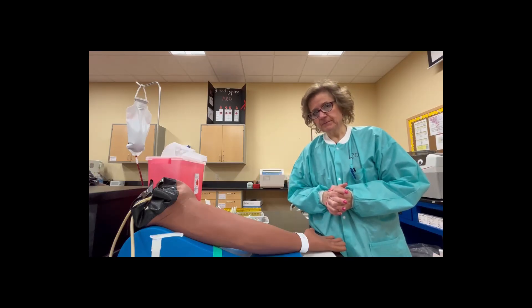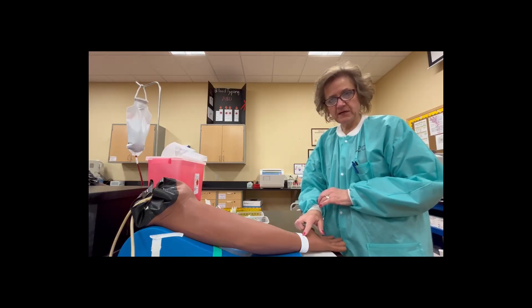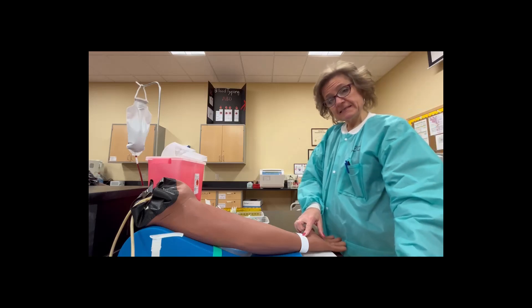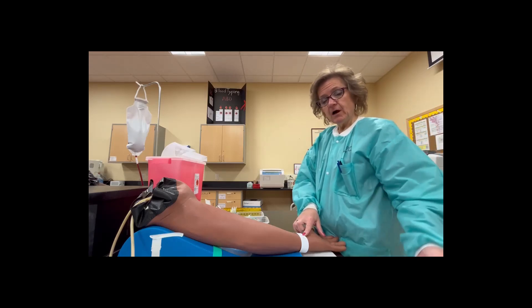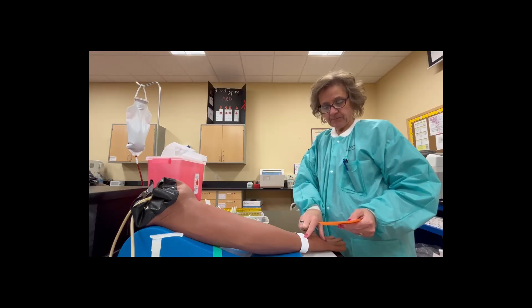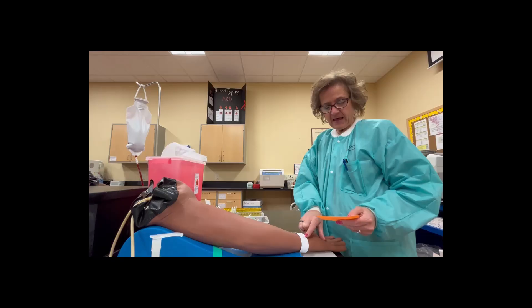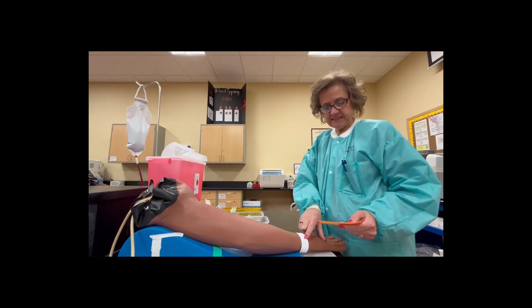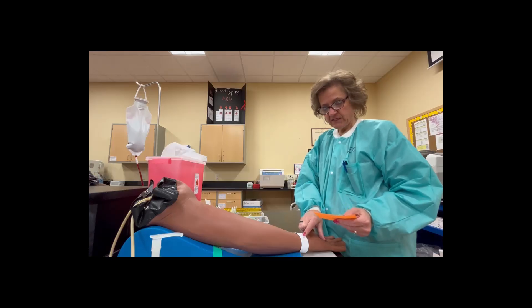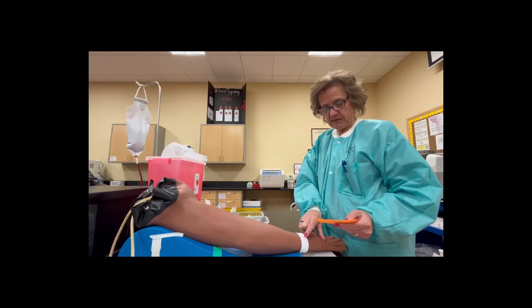If you're dealing with an inpatient, they're going to have a wristband with the patient information on it. If they are conscious you can still ask them their identification information. I've got my order here and I'm going to check that the name is correct — last name, first name, and medical record number. In this case the last name is Tation, T-A-T-I-O-N — they both match. First name Tim — they both match. Medical record number 99979 — this patient and this order go hand in hand.